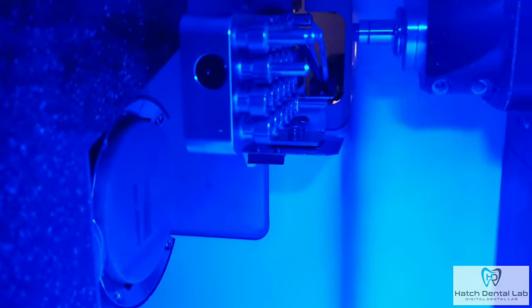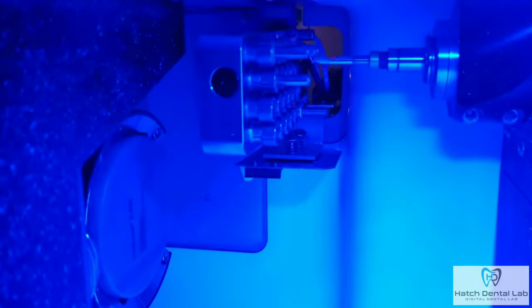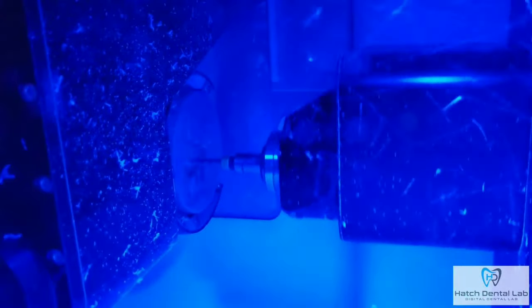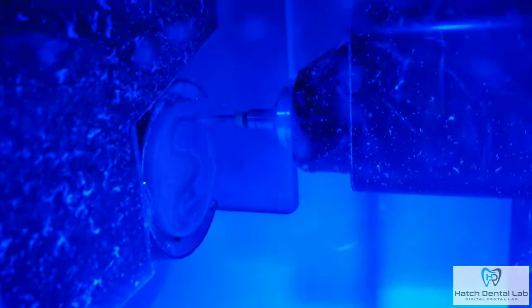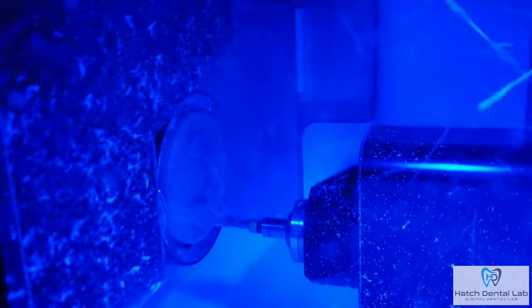Here, you see the mill roughing out the denture to remove the bulk of the unwanted material. As you can see, the mill is moving with exactness. This is another huge reason our milled dentures fit so well — there is not a lab tech doing this by hand. Human hands, no matter how trained, can't be perfect. The mill manufactures the perfect fitting denture every time. Since we've been doing milled dentures, our offices have told us they are seeing patients back way less for adjustment appointments. There's virtually no shrinkage, and it will help eliminate sore spots.